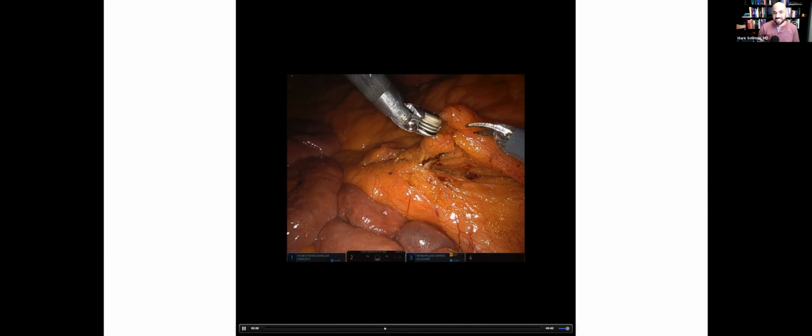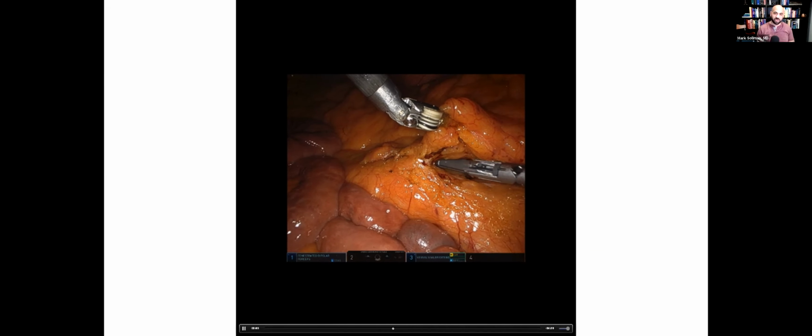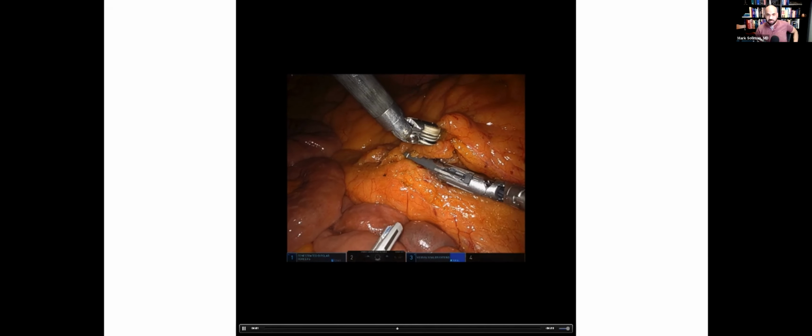Okay, so notice here, do you guys see the ureter? Negative. Do you see a window above the IMA pedicle? I don't. And full disclosure on this video, I'm actually moderating a panel in a few days at ASCRS on this exact same topic, which is where I borrowed this video from.